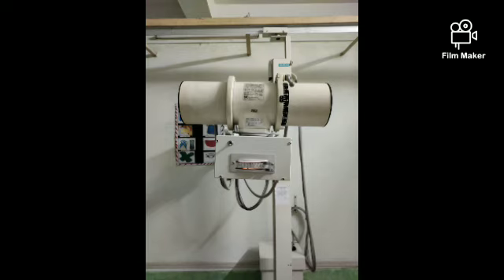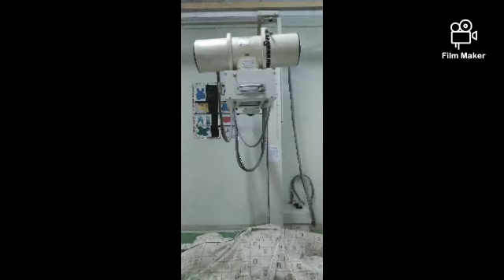While you are positioning the tube, it should not have any kind of angulations. The beam should be vertical. You can see here, and we are going to select an SID of 100 centimeter. So this is how you select the centering point. See now the patient is positioned.